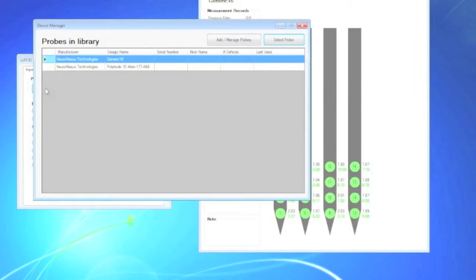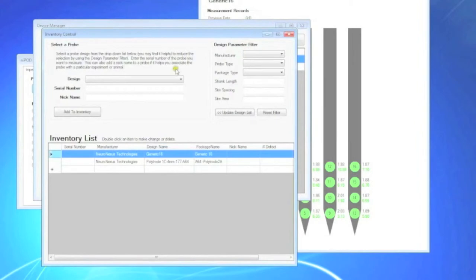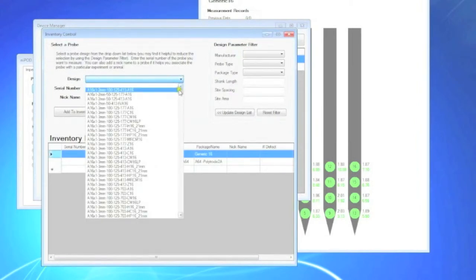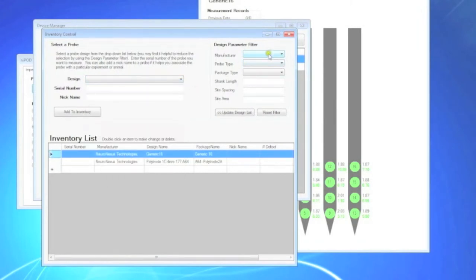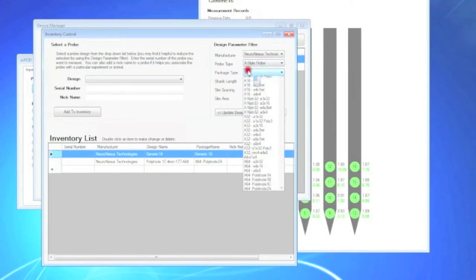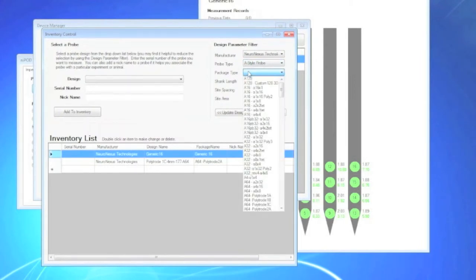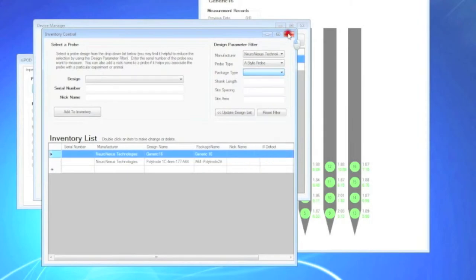You will need to add each probe to the Nipod database so that you can keep track of the measurements. To add a probe, you can search through the available probes or you can filter for a specific probe by following the steps on screen. It is helpful to select the exact probe design and package as the electrode sites will be mapped and visualized appropriately.